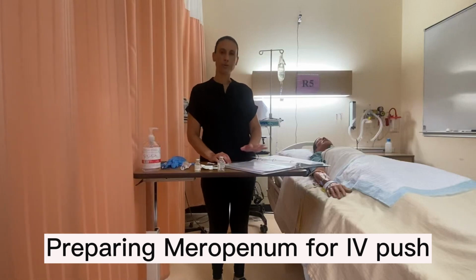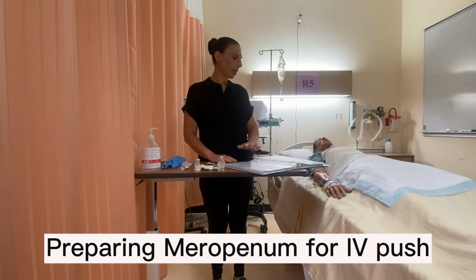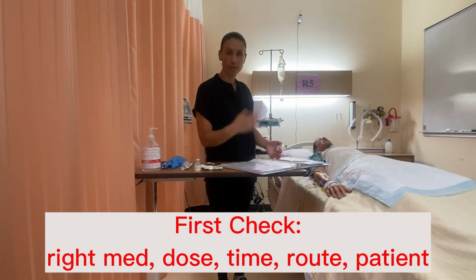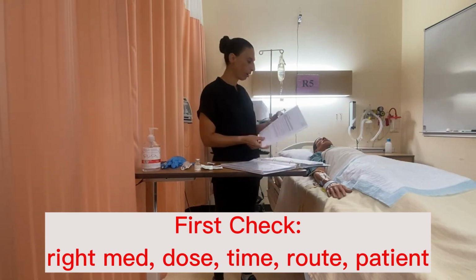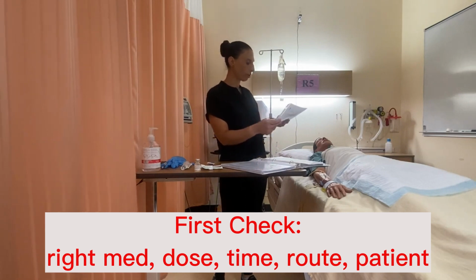This video will review mixing an IV push medication. So I'm going to do my first check here and also review my PDM to make sure that I, as a student nurse, can give this medication, which is Meropenem. So verifying the name, and also turning to my MAR, make sure that I have the order for Meropenem 500 milligrams.